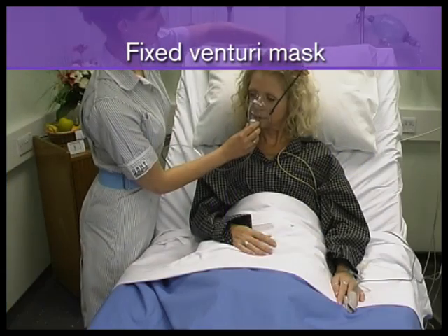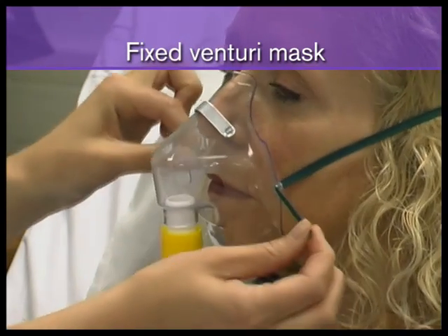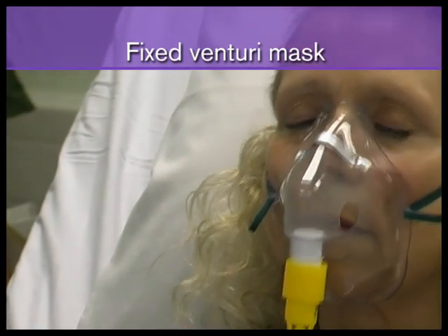Place the mask over the patient's nose and mouth and tighten the elastic to obtain a secure and comfortable fit. If the mask has a nose clip, it should be pinched to provide the best possible fit.